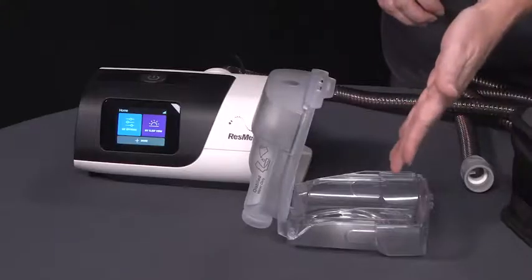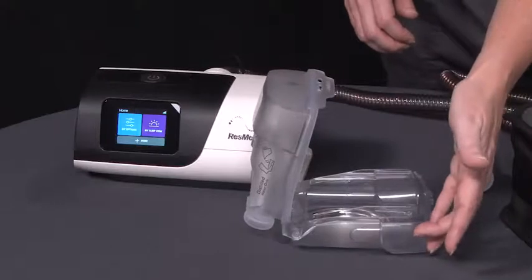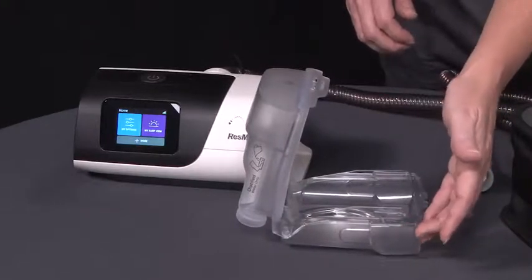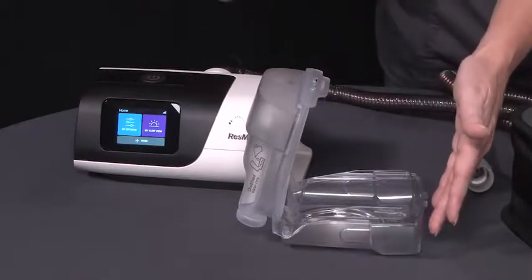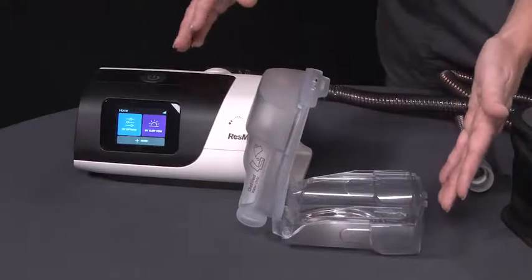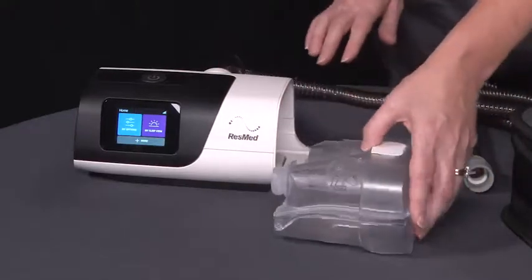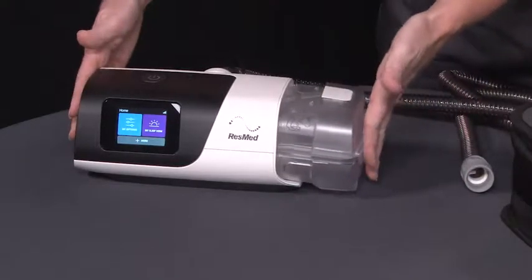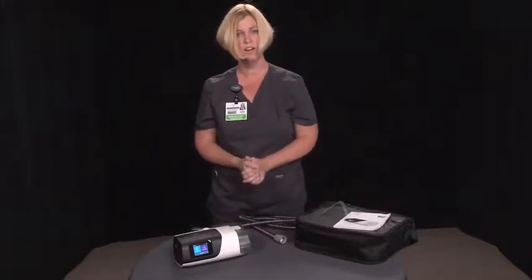You will pour your distilled water into the water chamber up to this max fill line. You don't want to overfill the water chamber, as it can cause water to back up in your machine and cause damage to the machine. You'll close your water chamber lid and slide this water chamber into your unit. Just press in until you hear that click, and that lets you know the water chamber is in place.